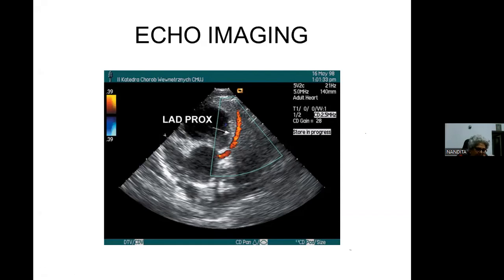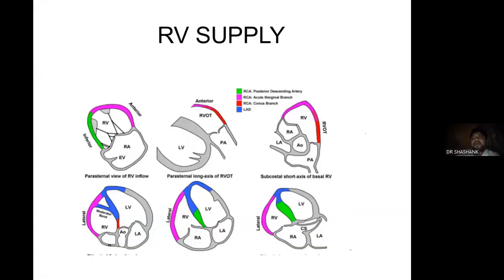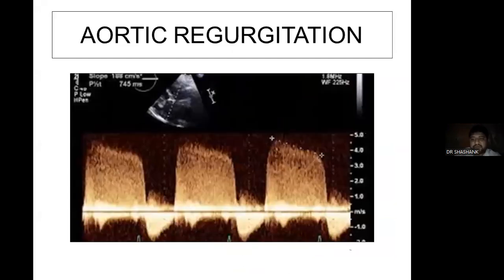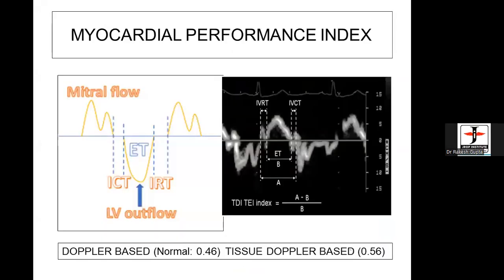Hello, sir. I want to ask about the myocardial performance index. What is the importance of the myocardial performance index, as we are already taking LVEF, which is virtually looking at systolic functions?